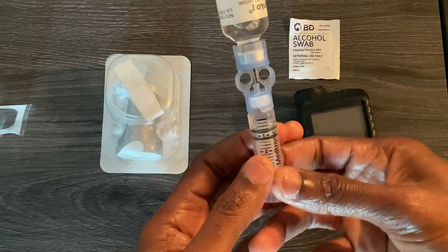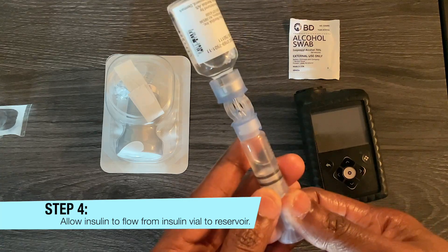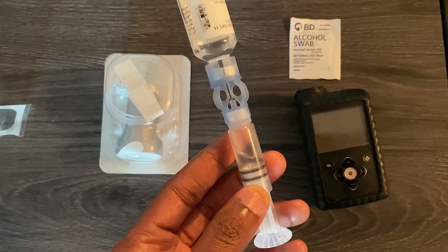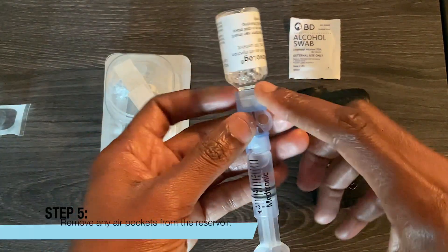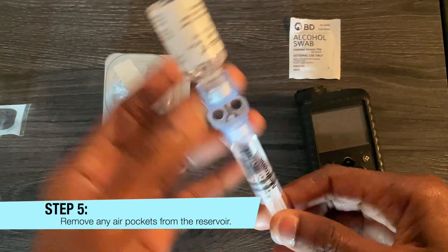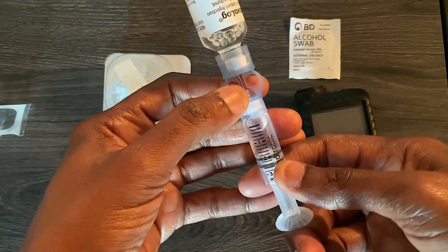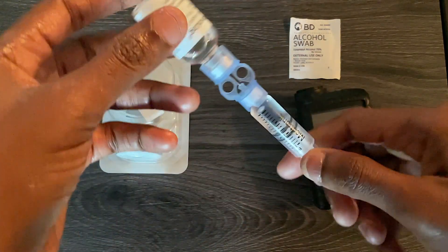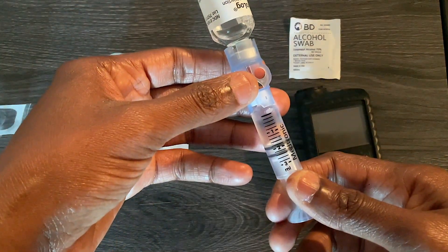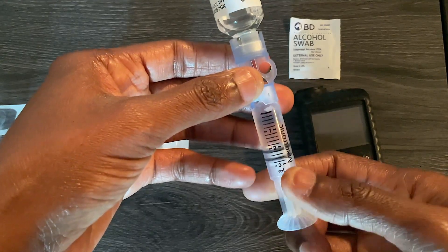Pull up some insulin from the vial — you start to see it being filled with insulin. Then push back any air you don't want. Push it all the way down to two, knocking that air back into the bottle. Now there are no more air pockets, so bring the insulin down to number two.